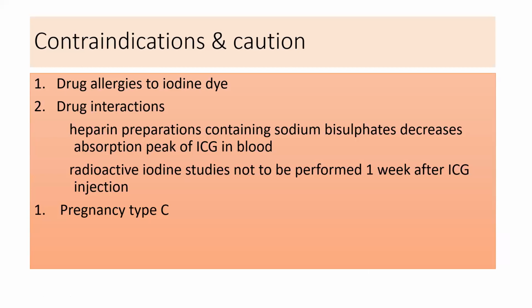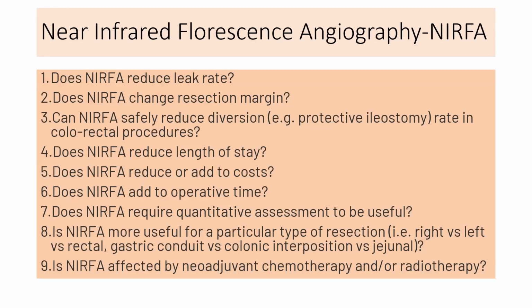There are certain contraindications. Drug allergy to iodine is one contraindication for this particular dye, because it is a weak iodine dye. Then there are certain drug interactions with heparin, so we have to be very careful. Radioactive iodine studies can't be performed 1 week after the ICG injection, and obviously high-risk pregnancy is a contraindication at present.